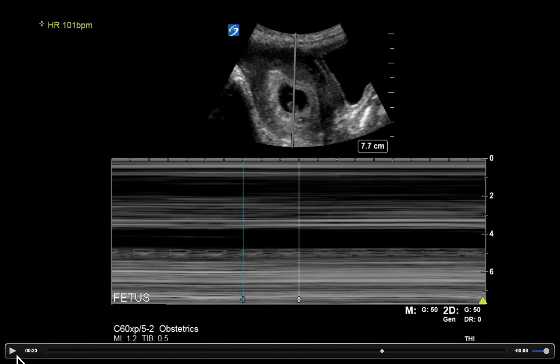We're then going to hit calcs on the machine, which may say 'fetal heart rate' or you may have to hit 'calculations.' That will give you a fetal heart rate measurement — it may say 'heart rate' — and then hitting that gives you the calipers.